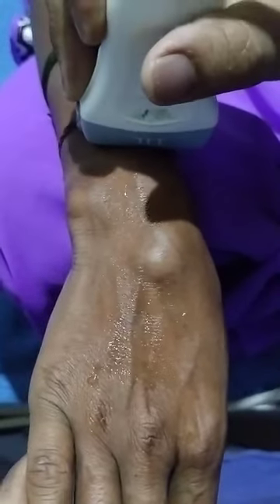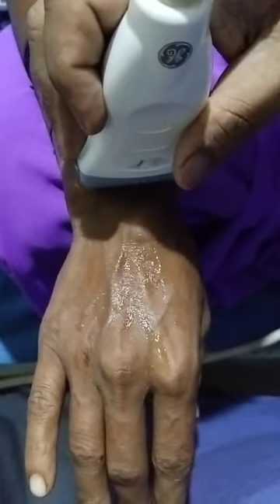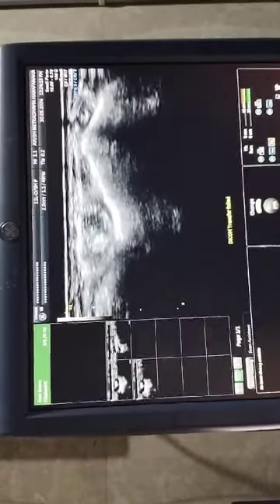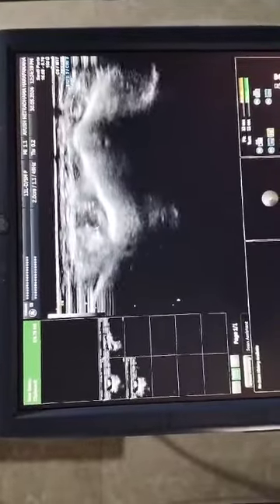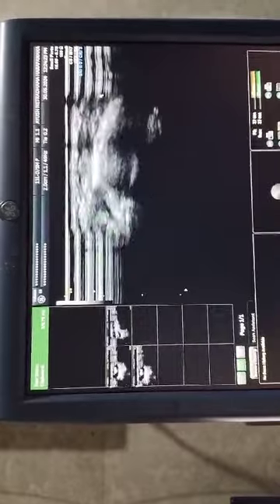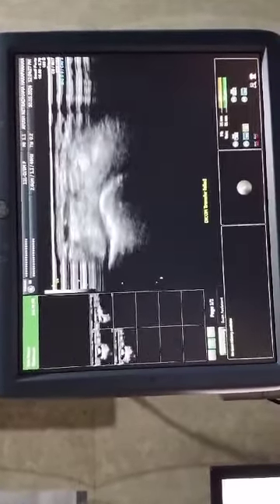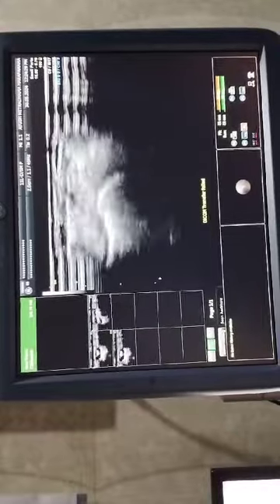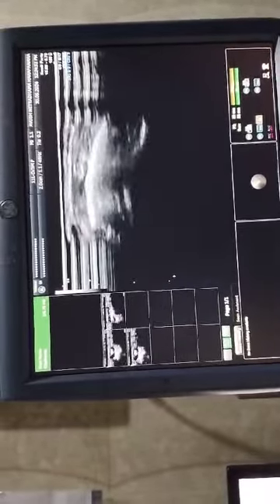Now we are examining with a high resolution scan. This is at the level of extensor digitorum at the dorsal aspect of the wrist. This is the extensor index tendon, extensor tendon.